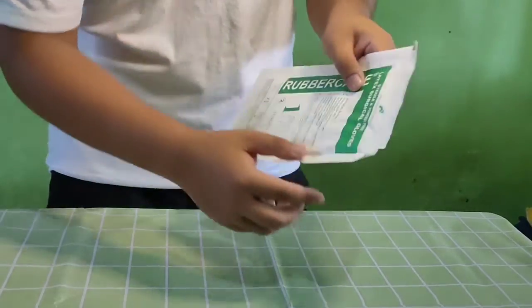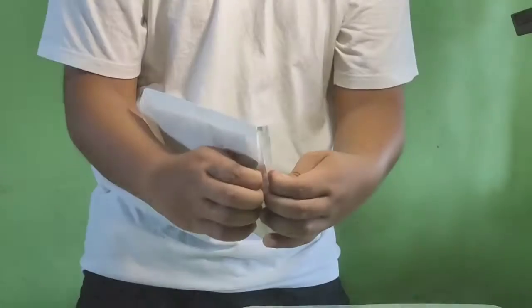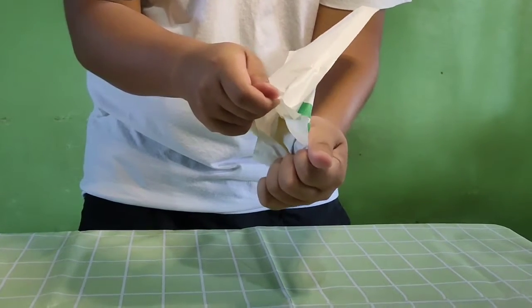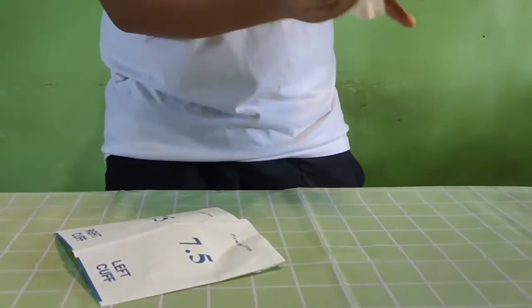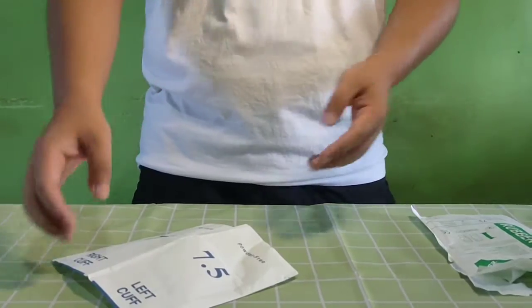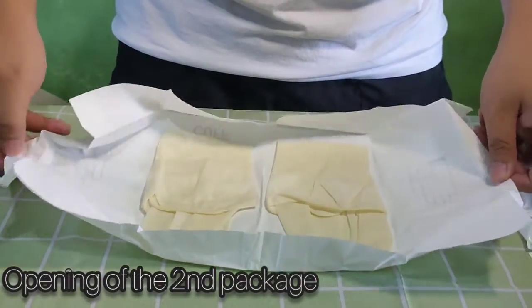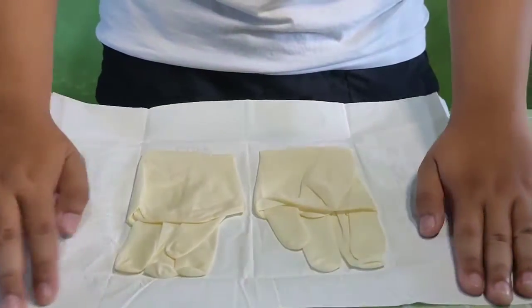Here, this says peel down to open, not to the side or to the bottom. Once finished examining the package, go ahead and peel the package. In doing this, make sure you have a nice and clean surface. Set this one up to the side, and set the package in its good position. Opening the second package, just touch the outside part only to avoid contaminating the gloves.